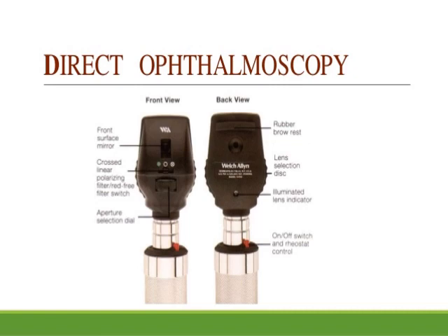This is the direct ophthalmoscope. On the front surface, you have a front surface mirror. You have a crossed linear polarizing filter or red-free filter switch, and there is an aperture selection dial. And on the other side of this, you have a brow rest, you have a lens selection disc, and you have an illuminated lens indicator. And then there is an on or off switch and the rheostat control. Through the lens indicator, you get to know if you are viewing through the convex or the concave lenses.